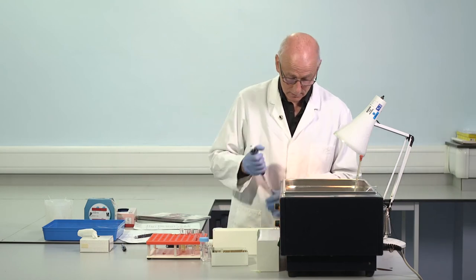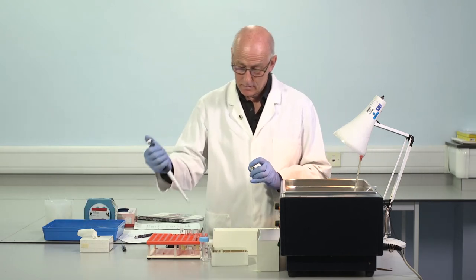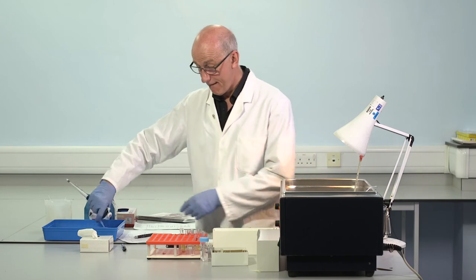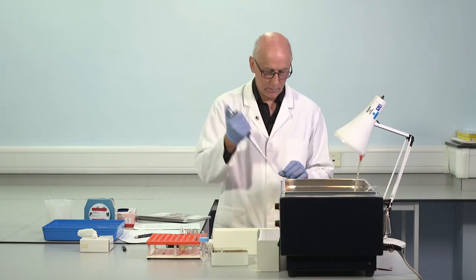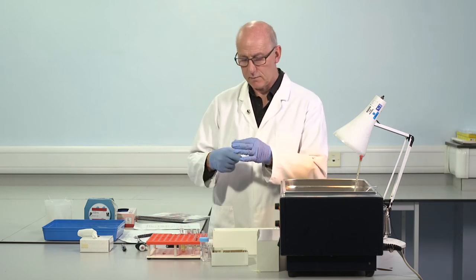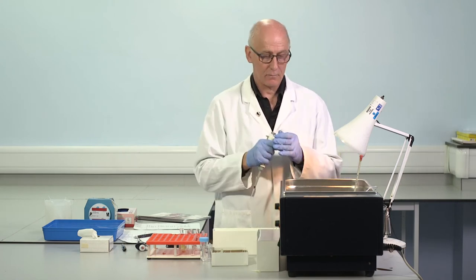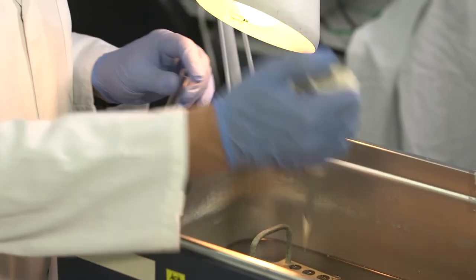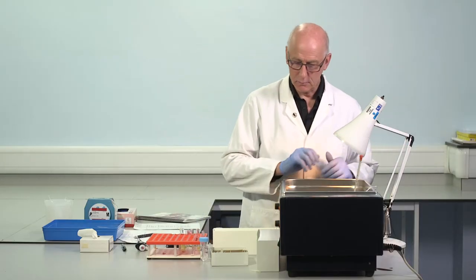Same pooled normal plasma. Plastic tube. Microliters in this case. Fresh tip. Patient number two. And mix. Two glass tubes. Immediate mix. No incubation at this point. 100 microliters each tube. Just warming up to temperature.